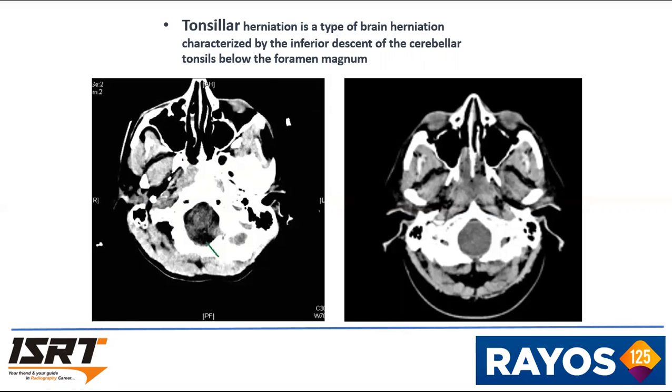This slide is on the first slices in the CT brain image. Some technologists may sometimes omit these slices, as they assume that the first slices are inappropriate for diagnosis or for filming. This image or slice is very important in CT brain imaging. Please check the foramen magnum. You can check the foramen magnum.